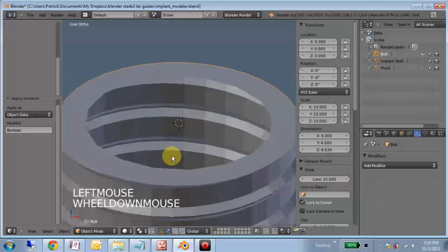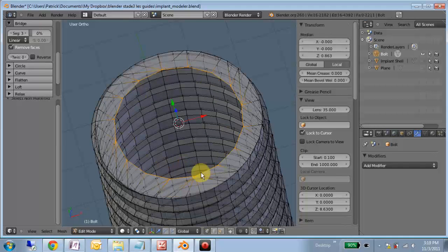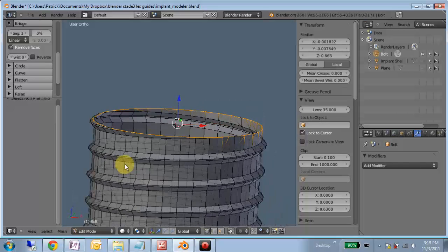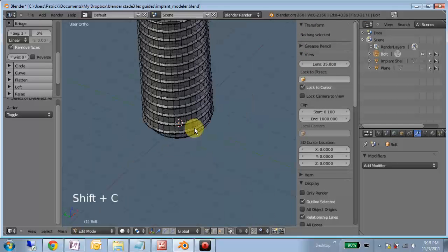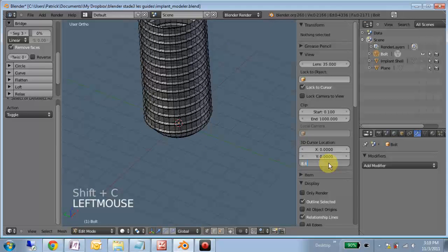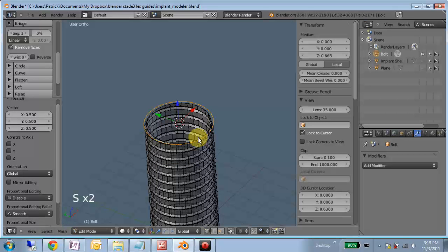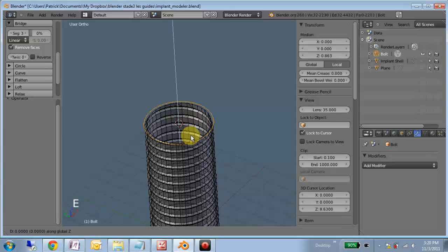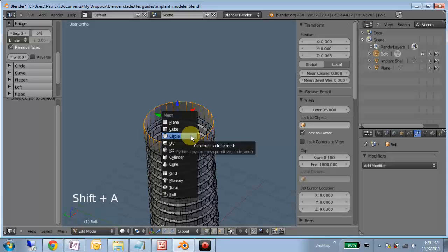We select this, apply this modifier, tab into edit mode, select non-manifold, get this nice ring, delete these. Now we have access to the ring at the top here. We can place the cursor at 8.63, add a circle, scale 4.1, scale 0.5, actually don't duplicate, extrude Z 1, Shift S, just selected, a circle.